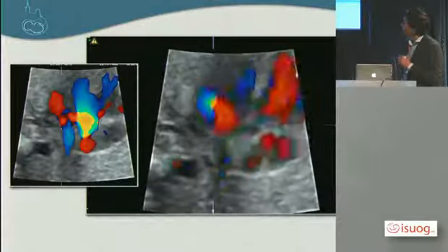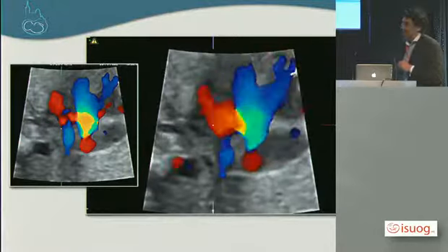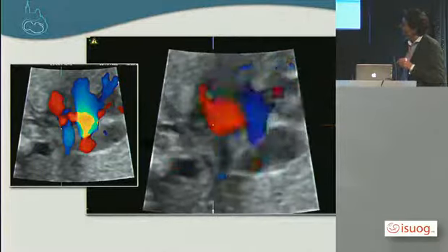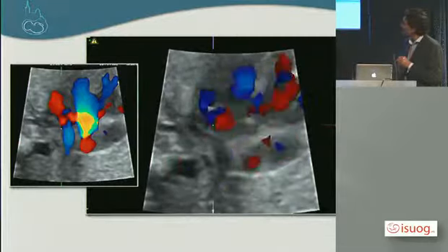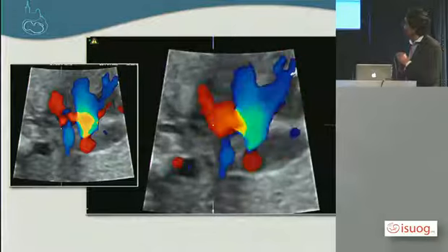Here in this situation, the pulmonary artery looks very good, the pulmonary roots are very fine, but the ductus arteriosus has an abnormal situation, usually always under the aorta, and you can see the retrograde flow, the backward flow, just here.